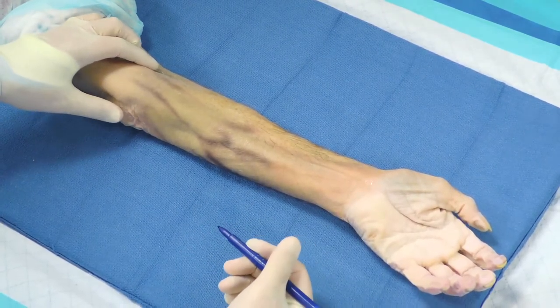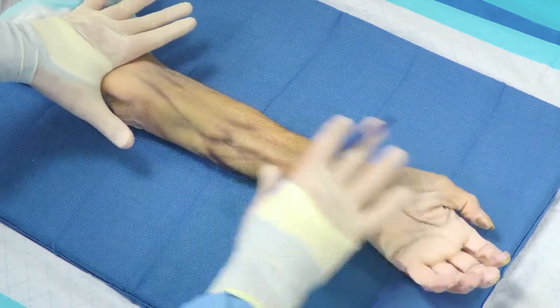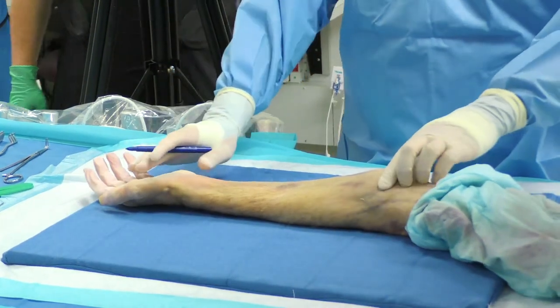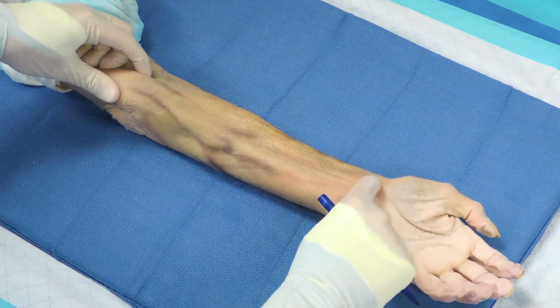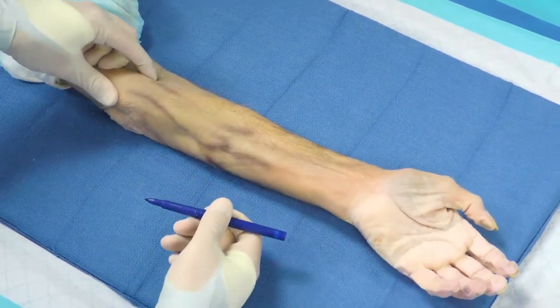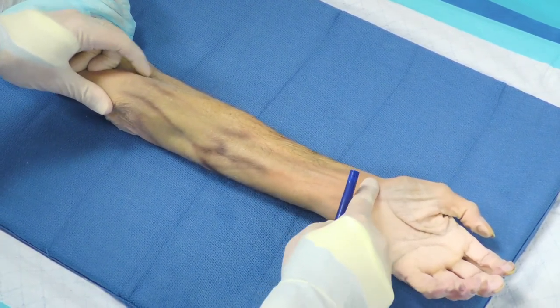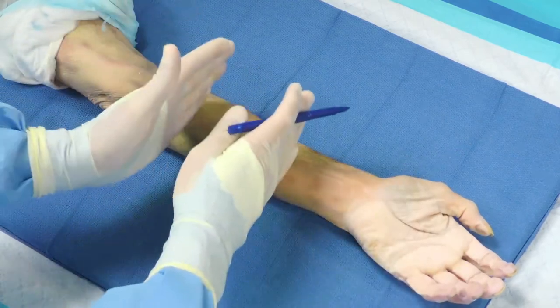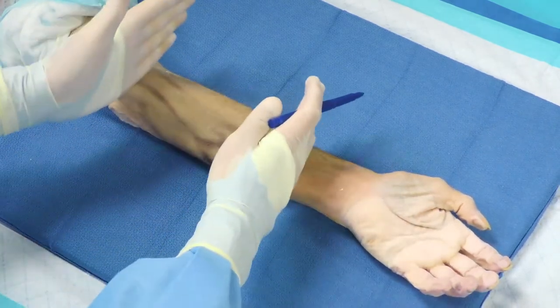The classic volar approach to the radial shaft is through the Henry approach. With the patient supine and the arm extended on a hand table with the forearm supinated, identify the two landmarks for the superficial skin incision: proximally the biceps tendon, and distally the FCR tendon or the radial styloid. Draw a straight line between the biceps tendon and the FCR where it crosses the flexion crease of the wrist — that line will be the superficial skin incision. Depending on which window you need for fracture fixation — proximal, middle, or distal — you can cut the portion of that line that will get you to the fracture for plate application.